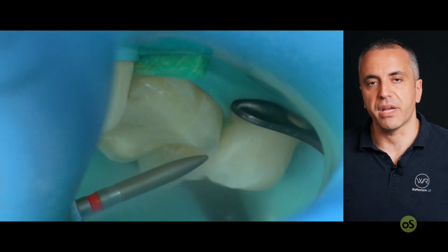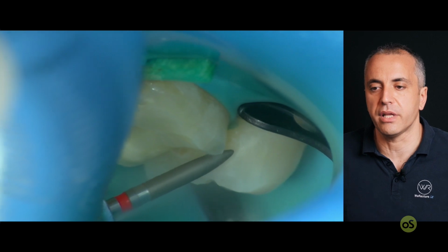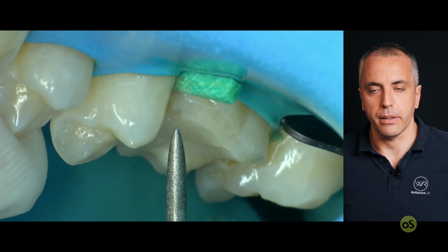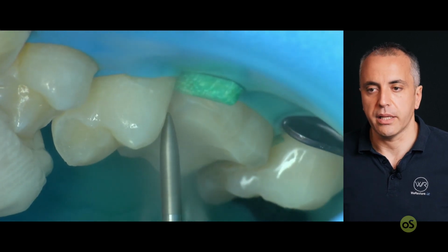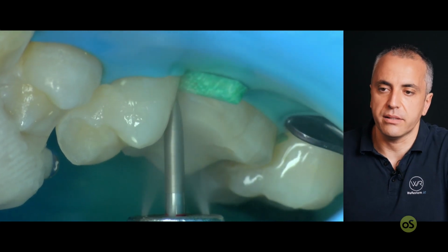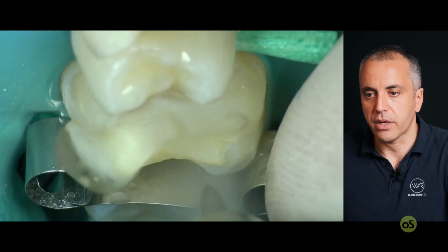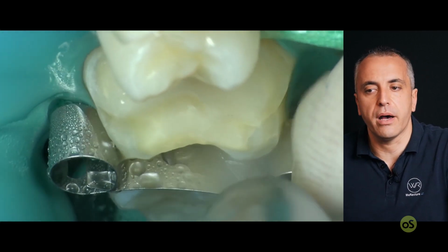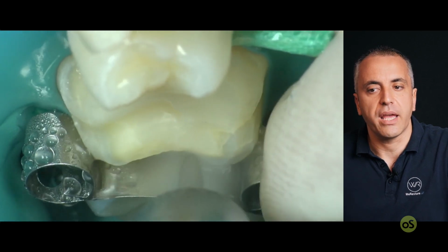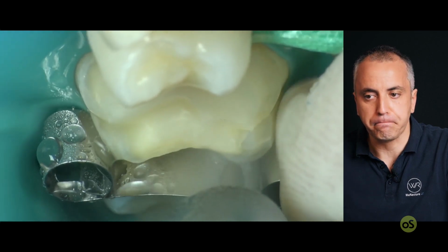Their retention was purely mechanical retention, so they needed to have straight areas, straight faces and preparation. Instead, while we can rely on adhesive dentistry, we use a rounded surface. Look at this, we put back the protection not to harm or damage the second molar. And now with the olive we create a smooth connection between the faces.